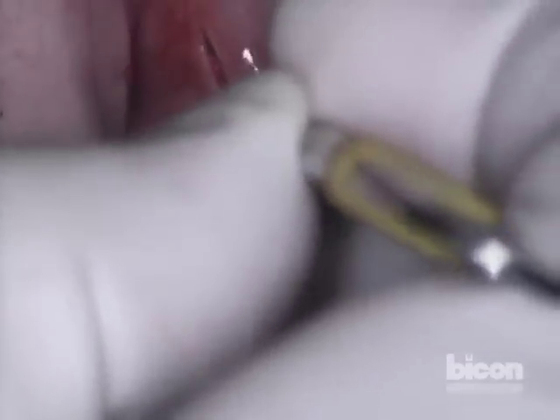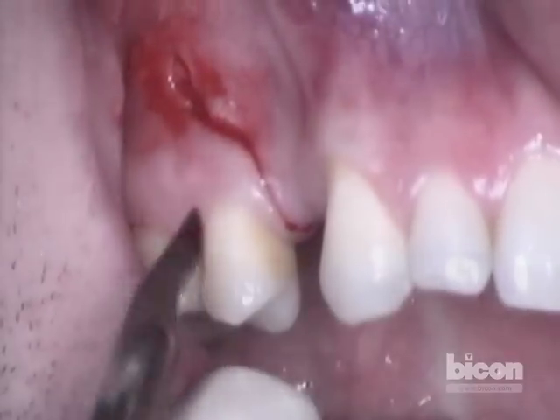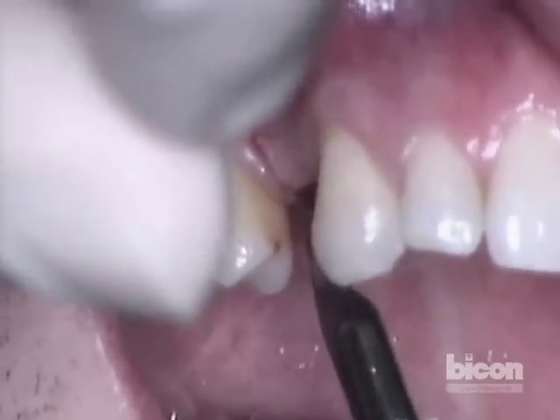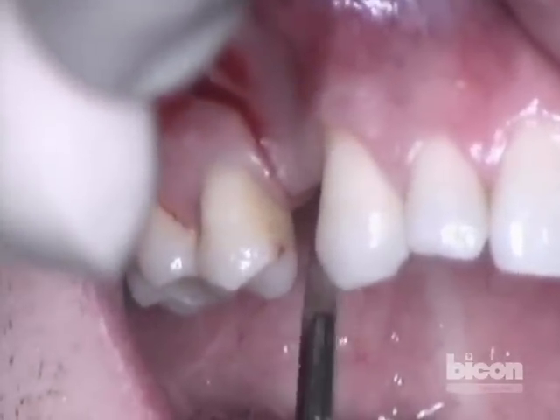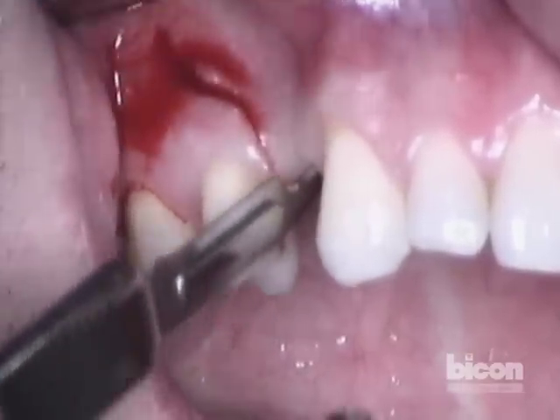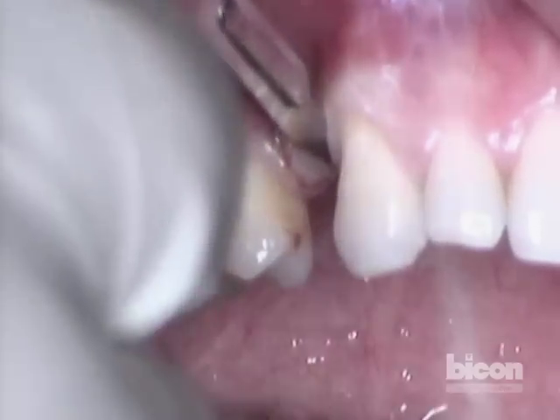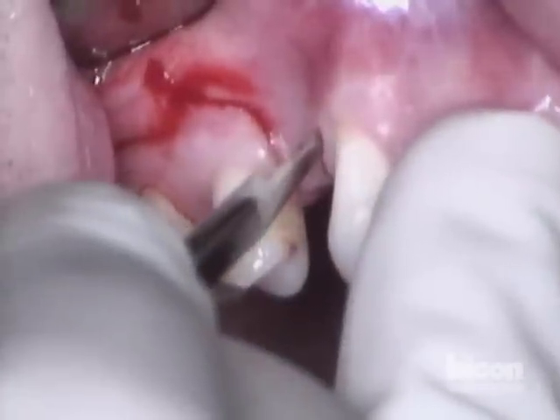Make sure that the incision is through the periosteum — it's a very loose mucosa. I want to make sure that this goes right against the bone. We will then turn it to preserve the papilla of the canine, and then continue on past the mucogingival junction and give it the paddle shape appearance.